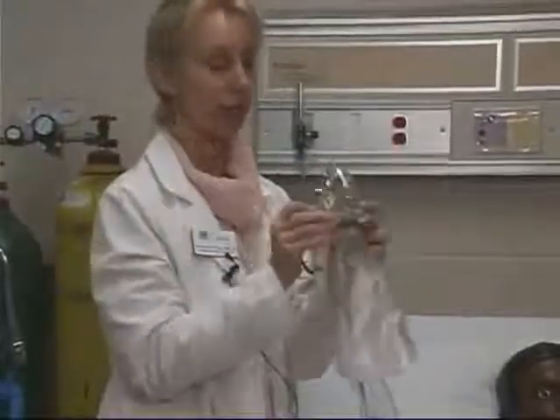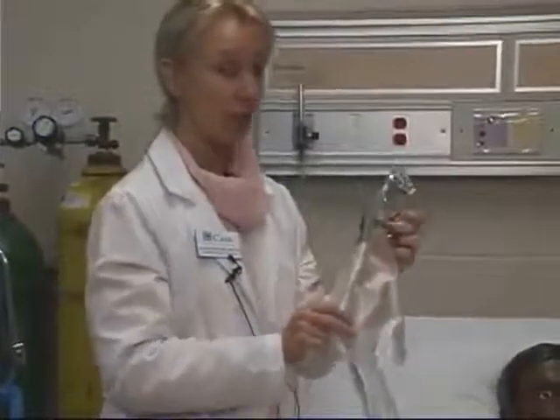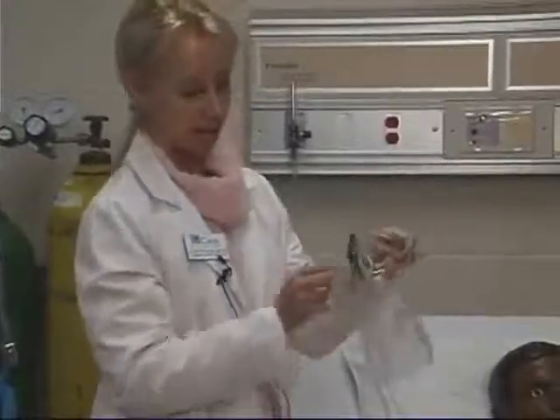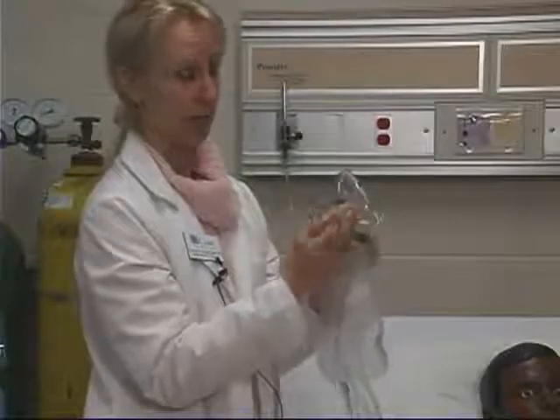So this is a very, very important safety feature, that on a non-rebreathing mask that has the valve in here, only one port has the rubber flap on it.